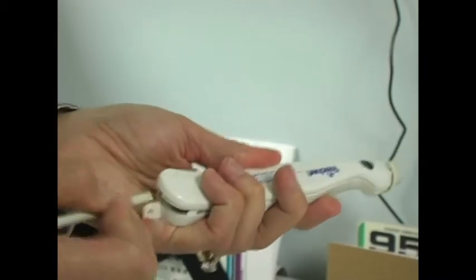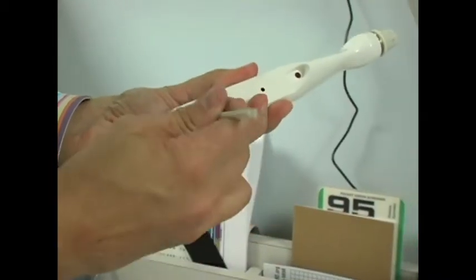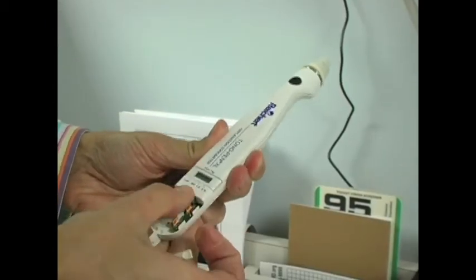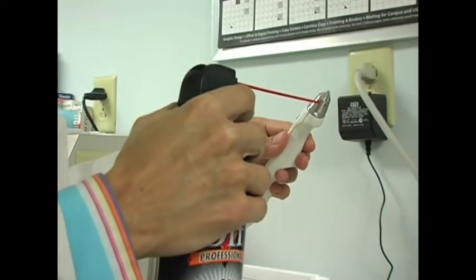Tonopens are battery-operated devices. You should have a regular maintenance schedule for the Tonopen, which includes weekly calibration, routine battery changes approximately every 4 months, and cleaning the tonometer tip with compressed air approximately every 2 months. Be sure to keep the air canister vertical, otherwise the liquid propellant would damage the Tonopen.